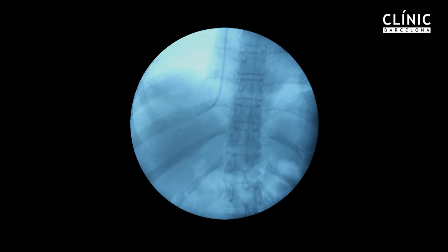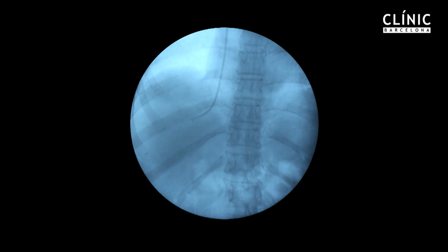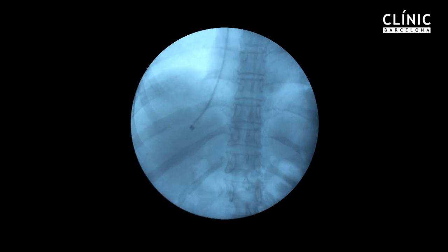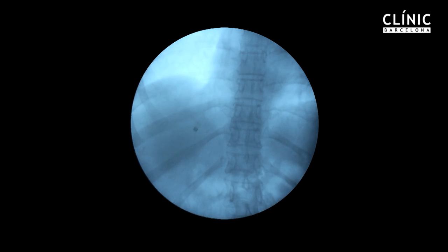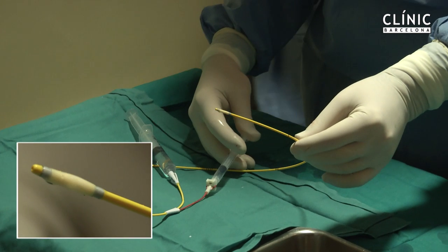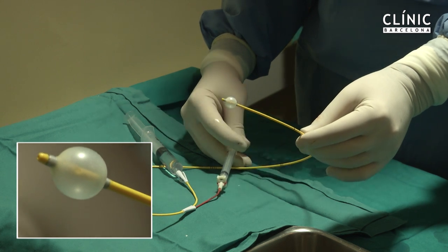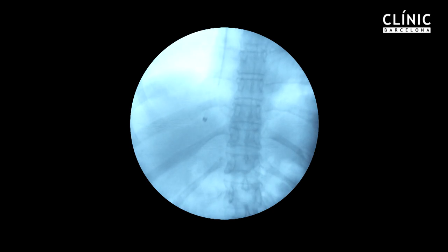A small amount of contrast dye is injected to verify the correct location, and then the introducer sheath is advanced over the catheter into the hepatic vein. This allows advancing the balloon catheter to determine the hepatic venous pressure gradient.